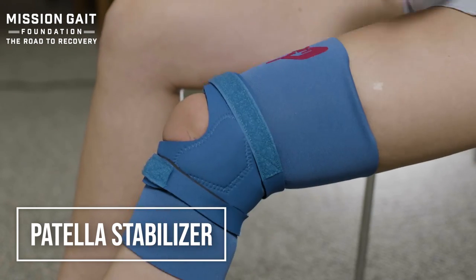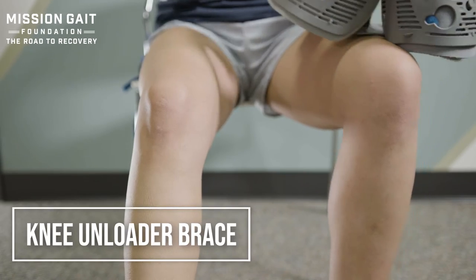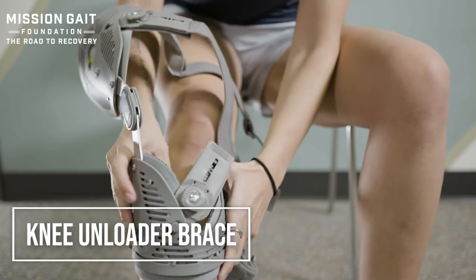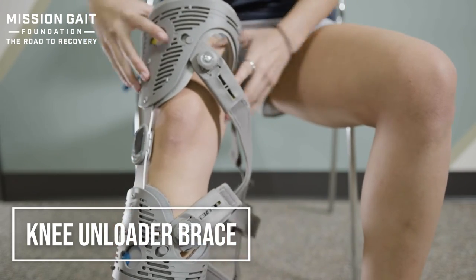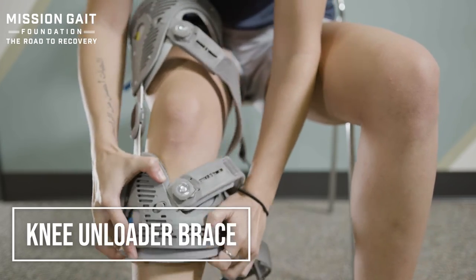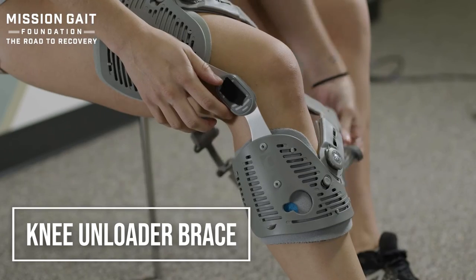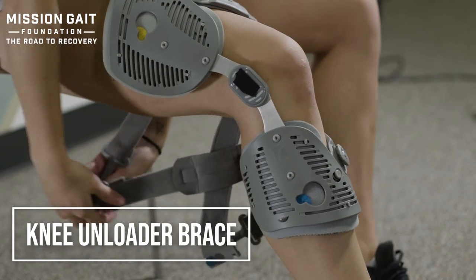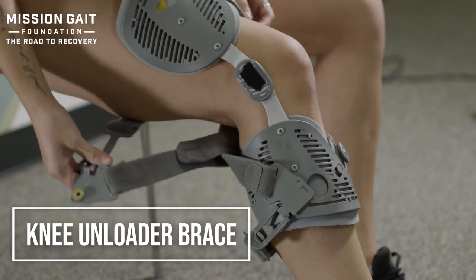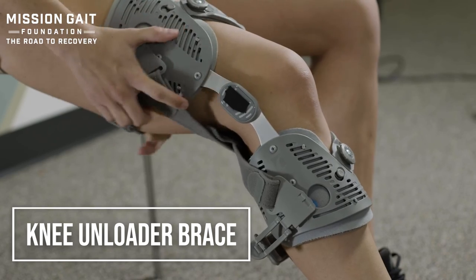From there, she takes the two straps and creates compression around the bolster on top and bottom, adjusting so she can pull more towards the top or bottom to create the compression needed — hugging and wrapping the outside of the kneecap to stabilize or move it medially. In these cases, the patella always moves laterally in an unstable manner, so you want to create lateral support.